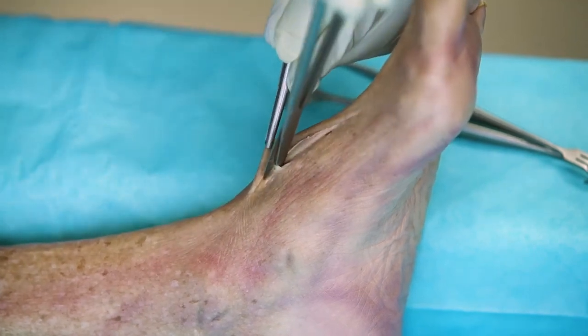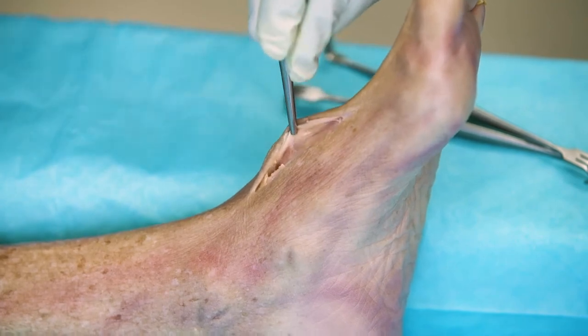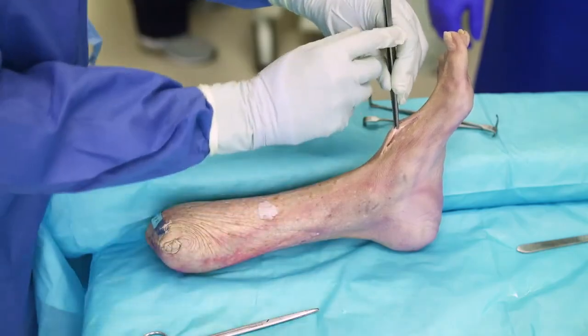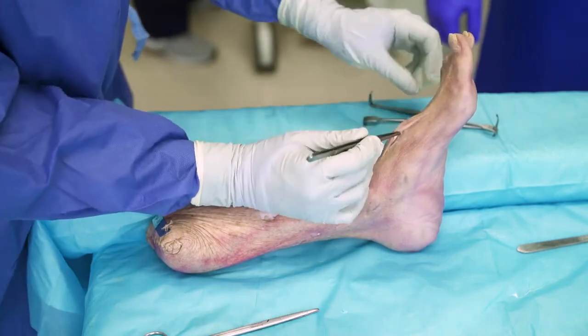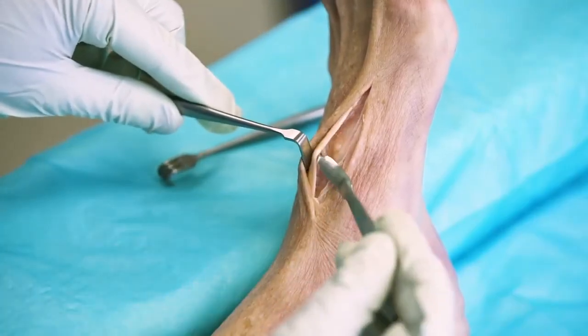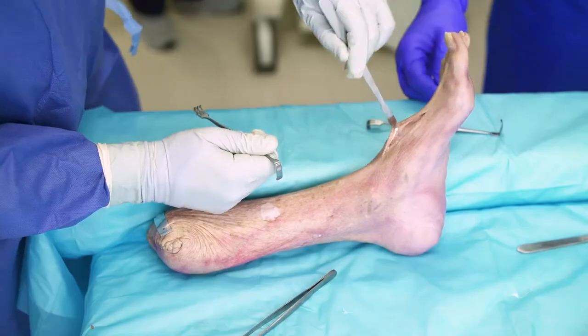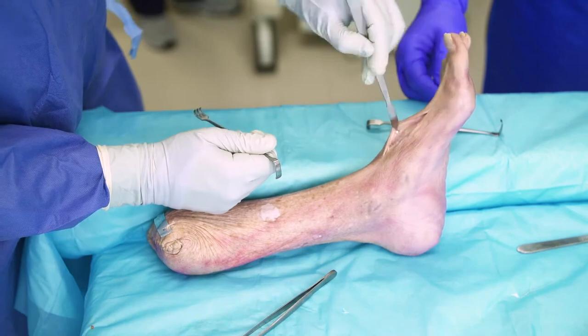The deep bundle is more lateral than this, but knowing where your extensor hallucis longus tendon is will certainly protect your deep neurovascular bundle of the deep peroneal artery. So here we have the extensor hallucis longus tendon, which we'll put a Hohmann retractor behind to protect it. That exposes our first tarsometatarsal joint.